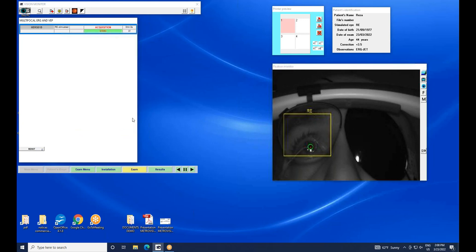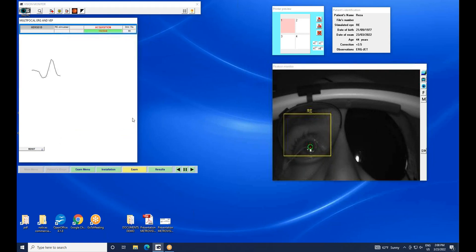Otherwise, the color of the message will become red and the faulty electrode will be indicated. For example, 1 minus for the reference electrode of channel 1.